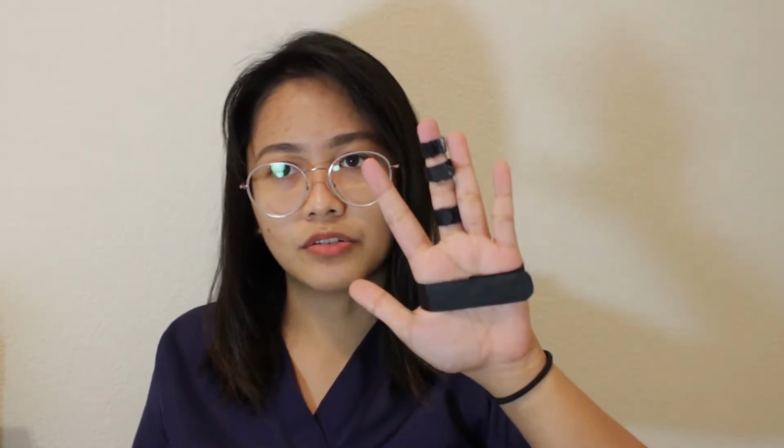it works, the splint. So if I had a burn on the underside, or on the volar side of my palm, this splint keeps it free and open and extended, so that when the scar tissue is forming, it doesn't form a contracture. Because the tendency is, if we have a burn on the palmar side of our hands, then we continuously keep our fists closed, the scar formation would contract, and that would hinder us from opening our hands later on during our therapy. So an extension splint would be useful to keep our fingers and palms open.